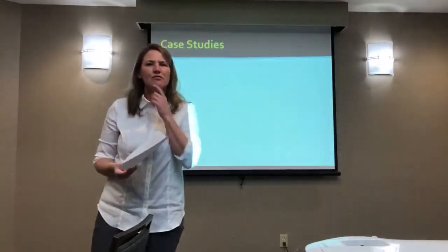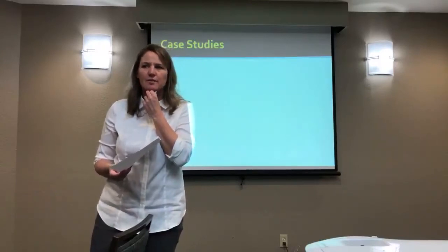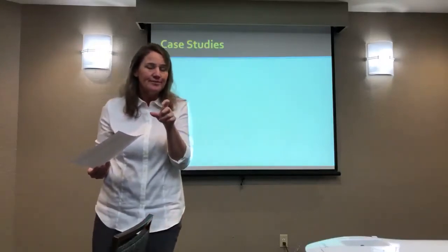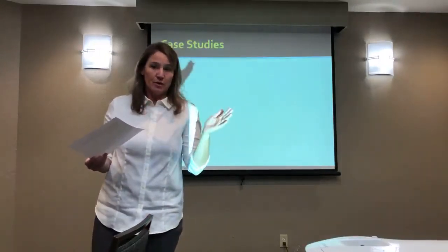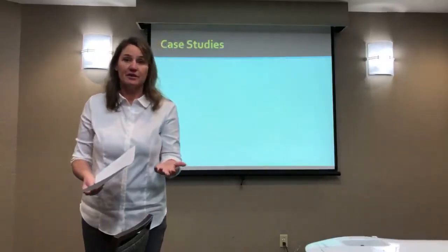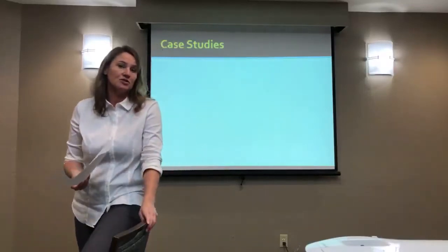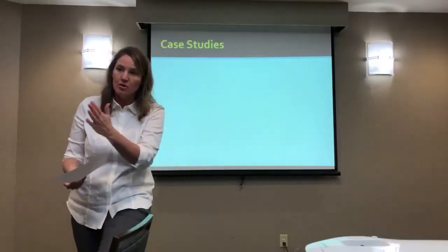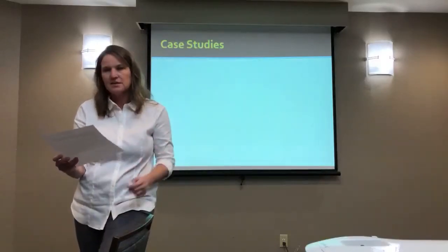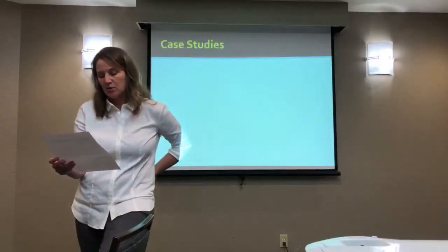And if they are large and there's any debate there, I always say, if we're questioning each other and we're saying, well, what frequency would you use? If I'm hearing crickets, meaning I'm hearing them really think about this and they're trying to determine how deep it is, if there's any doubt, my thought is the more conservative approach would be to go 1 megahertz because it's going to get there. At least I know it's going to get there. And I can always back off, but I just want to make sure it achieves the target and gets through the whole ligament. So if there's any doubt, but in this case, we're going to base it on the size of the person, and 3 megahertz is very likely going to be okay.